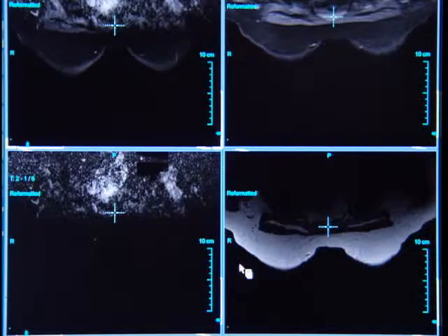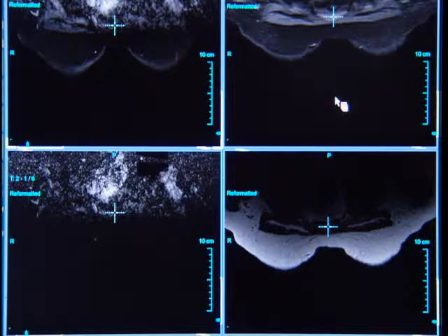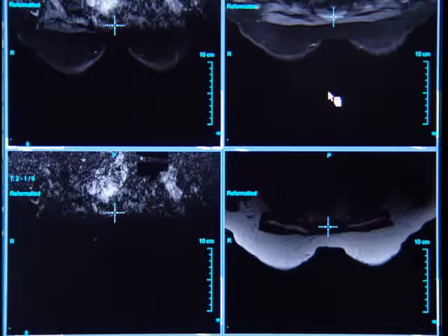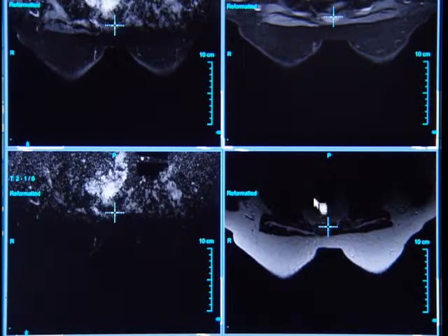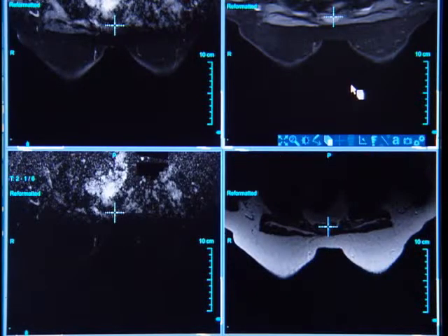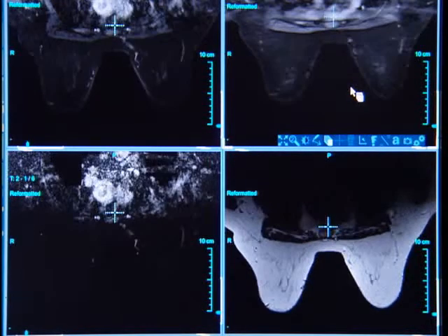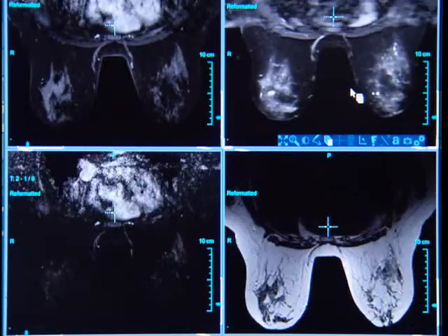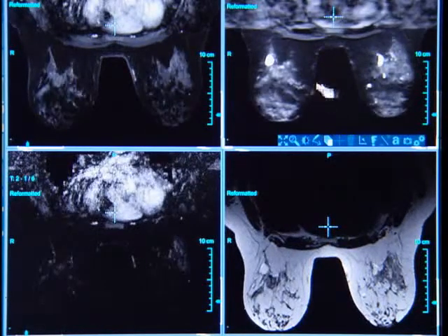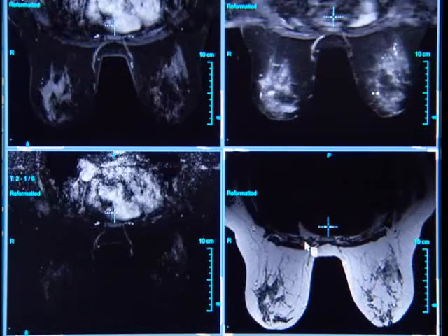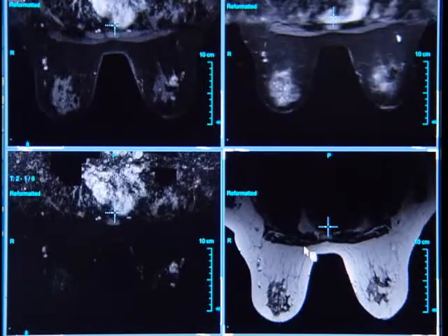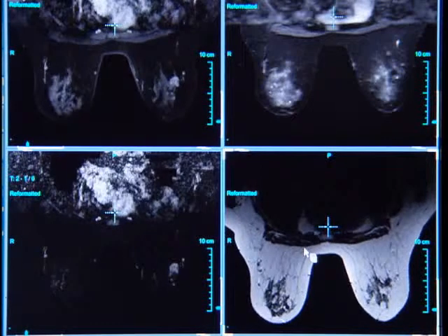Our next pull-down menu brings multiple acquisitions up simultaneously. This allows us to correlate from pulse sequence to pulse sequence the signal characteristics of abnormalities. Initially, we can evaluate in these two screens our T1 and STIR imaging. They're cross-referenced and you can analyze for parenchymal density, evaluate for cysts and asymmetric parenchymal or skin edema, as well as evaluate the axilla and internal mammary lymph node chains for lymphadenopathy.